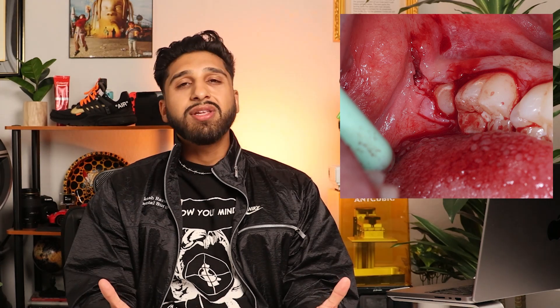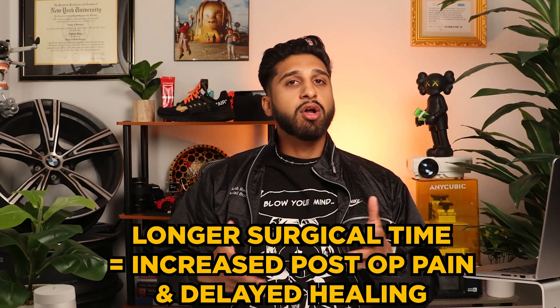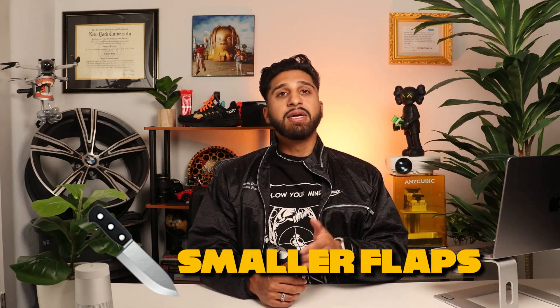This technique allows for lifting of the gums and achieving a clean separation from the bone. Here I could have made a better incision towards the second molar, creating a cleaner and larger flap. I've noticed that larger flaps make the procedure easier for me without necessarily causing more trauma or post-operative pain for the patient. It's important to understand that longer surgical time, rather than a larger flap, contributes to increased post-operative discomfort and slower healing. So if you need to make a bigger flap to get a tooth out in half the time, it's a no-brainer.